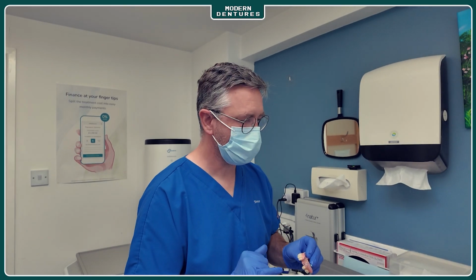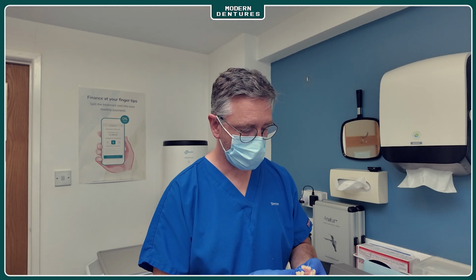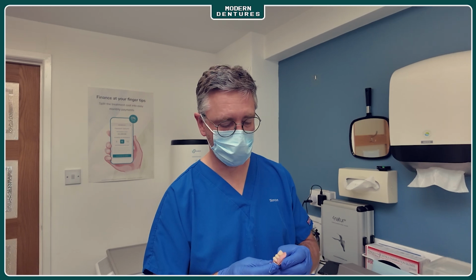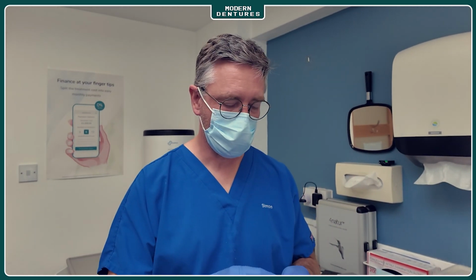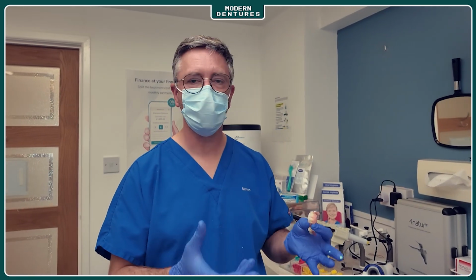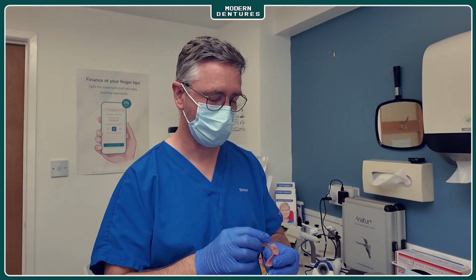We're not doing an upper on this one, so I'll let the technicians decide which size teeth they're going to put in. On this it looks like we've got P6s on the upper backs, so we'll put P6s on the lower backs, and then I'll just suggest for the technicians to choose the lower anterior teeth, because they might want to change it a little bit depending on the size of the front teeth and where they're going to fit in. And it's a lot easier to do that sometimes once you've got the impressions cast up and you've got the models in front of you. You can eyeball it a little bit better, but otherwise I like to normally pick the teeth myself.